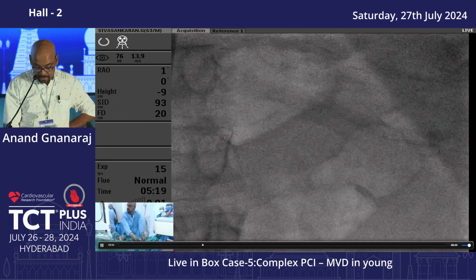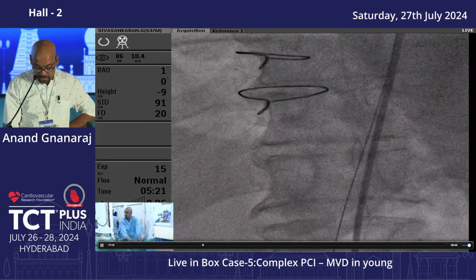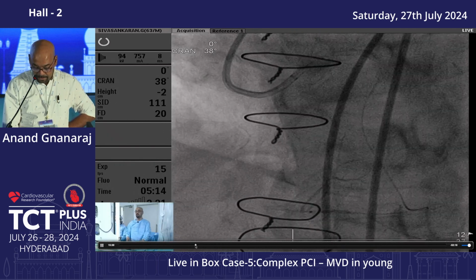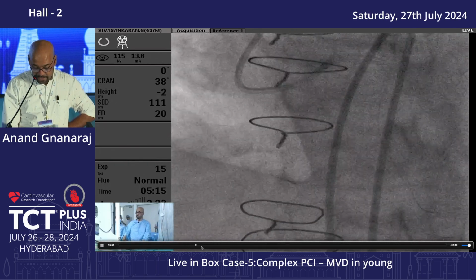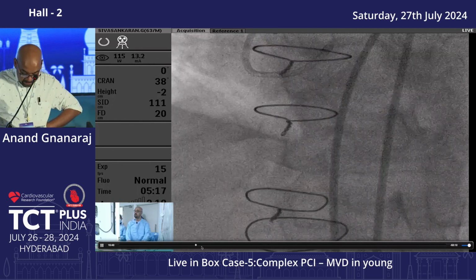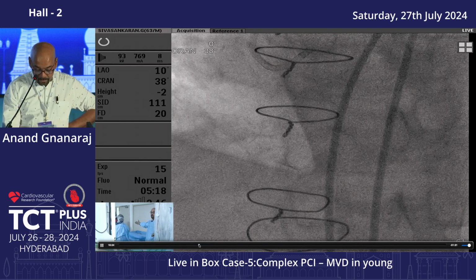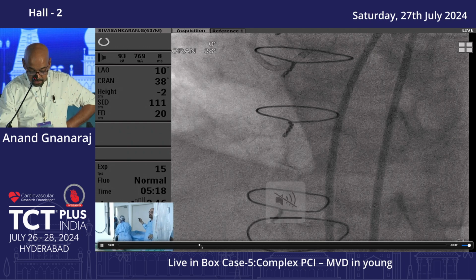And this time, sheath kuda, IABP sheath. Oh God. Oh, sorry. You have to pull out. After this injection, again he fibrillated. Give push on artery. Okay, so all these dramatics were going on.